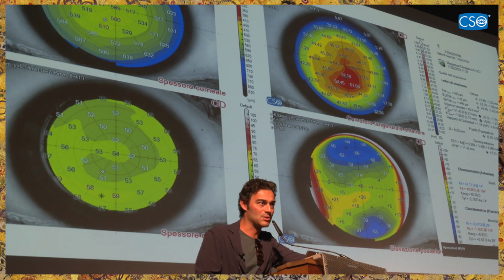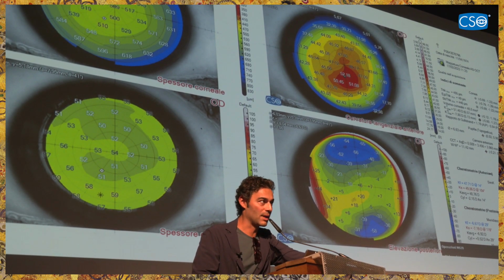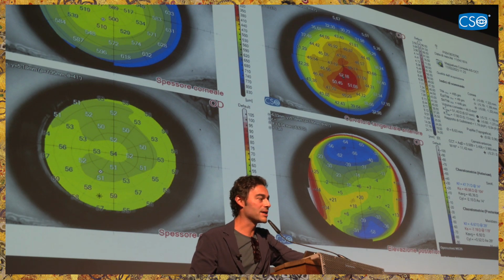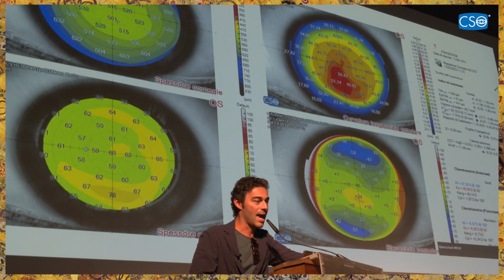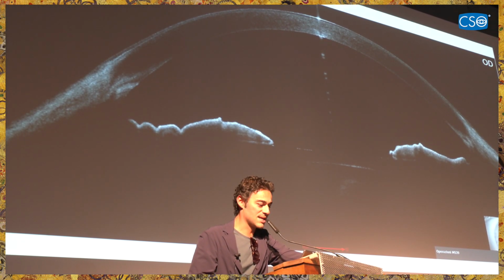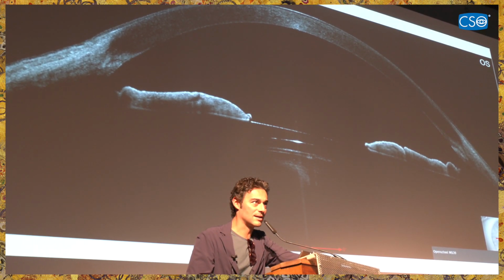But let me show you a few interesting cases we can spot out with the MS-39. The prediction for ICL surgery is not always straightforward because, as always in medicine, we have outliers. And a big group of outliers in ICL sizing is keratoconus. For instance, this is a patient with some keratoconus in both right and left eyes, and all our predictions were wrong. Also, the predictions coming from the OCOS website were wrong, because as you can see, also in this case, the ICL is resting on the crystalline lens. So the vaulting in this case is 0 in one eye and close to 0 in the left eye.